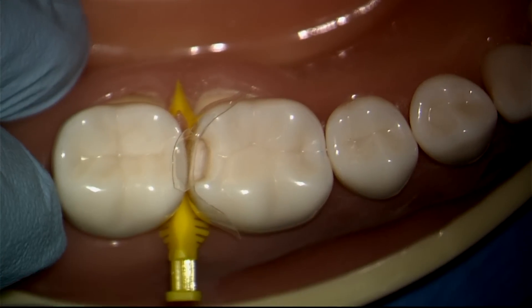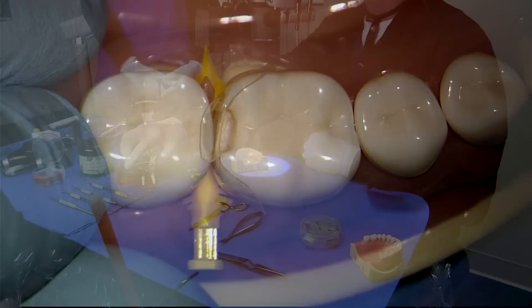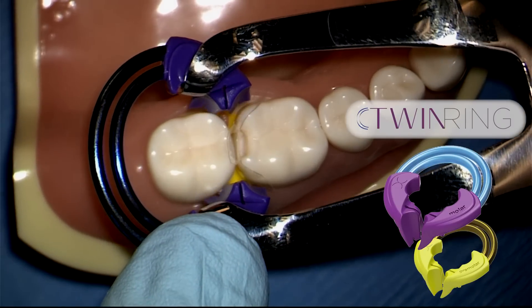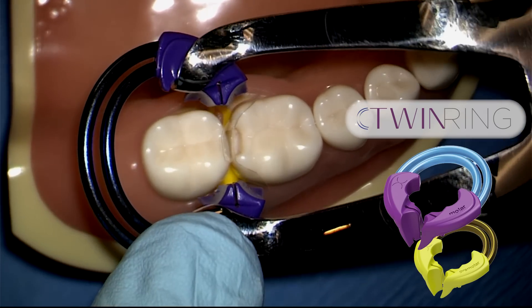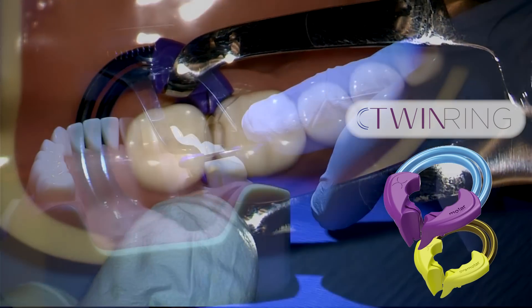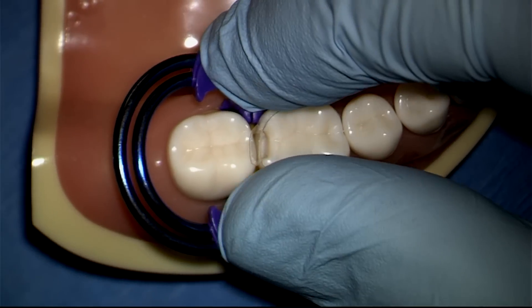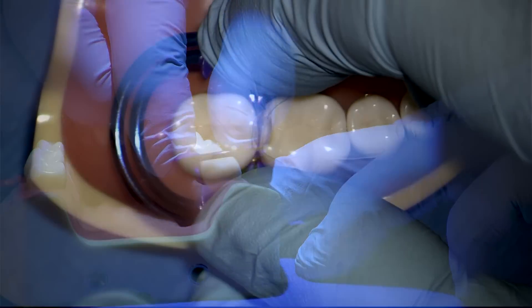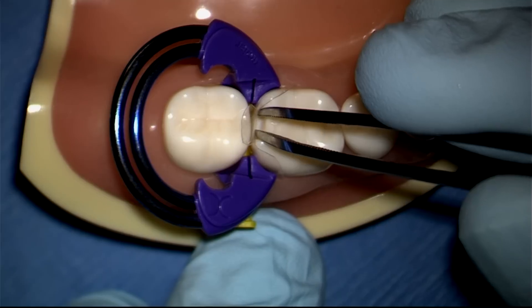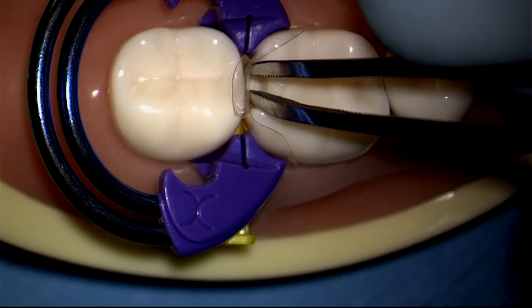You can see that it's fully inserted. I can give it one last push with the back of the cotton pliers. The next thing we're going to do is to place the twin ring. It can be placed in either direction, but in this particular case it's going to be advantageous to put the twin ring toward the distal. Make sure you expand the cotton pliers enough to not catch the matrix. Don't worry about overstretching the ring — this has super advanced spring technology with the twin nickel titanium, and it won't wear out like normal separators. I'd like to go ahead and push the separator down one last time to make sure it's fully seated, then expand the contact to make sure I've really taken advantage of the full shape of the matrix.